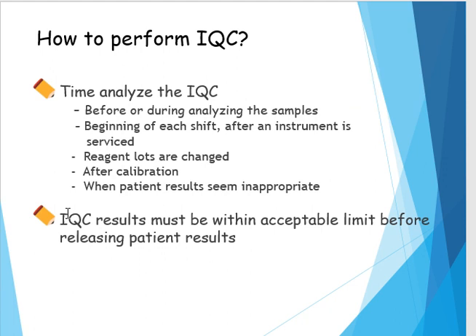And how to perform the IQC? Okay, now we have the QC. How to use the QC? It is based on the time of analyzing the QC. So when to analyze the QC? Of course, we need to analyze it before or during analyzing the samples, or at the beginning of each shift, or after an instrument is serviced, or when the reagent lots are changed, because we want to make sure that the reagent is good. After doing calibration, of course, we need to perform QC, or when the patient results seem inappropriate. IQC results must be within the acceptable limit before releasing the patient's result.